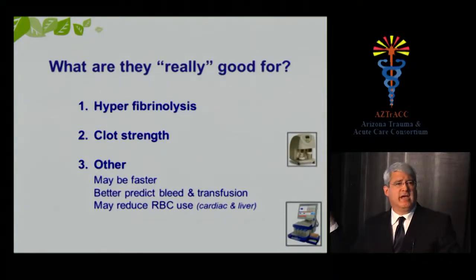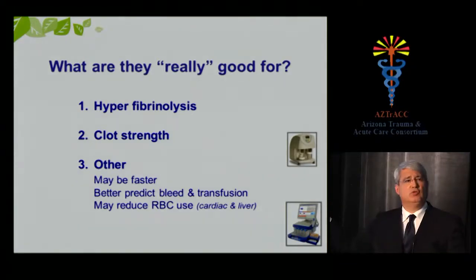And this is my own experience. At Sunnybrook, we have both. We have been playing with TEG and ROTEM, and I'll tell you my experience: what are they helpful for? I think they're helpful for two things. They're helpful to diagnose hyperfibrinolysis. They're helpful to diagnose a weak clot. And then there are a few other things that I'll talk about quickly.